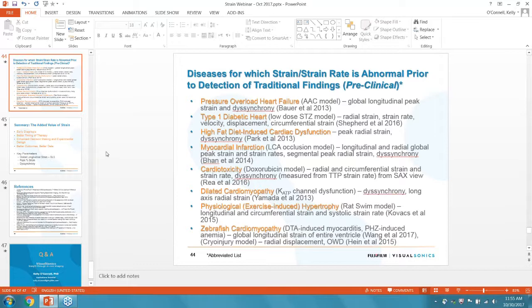One of the things I mentioned earlier during the talk is the normal progression, or at least what we think is the normal progression of systolic dysfunction, is that there is diastolic dysfunction first, then there's systolic dysfunction. We still use ejection fraction and all of those parameters, but if you wanted to see early, you would do your E and A and your E prime, A prime information.